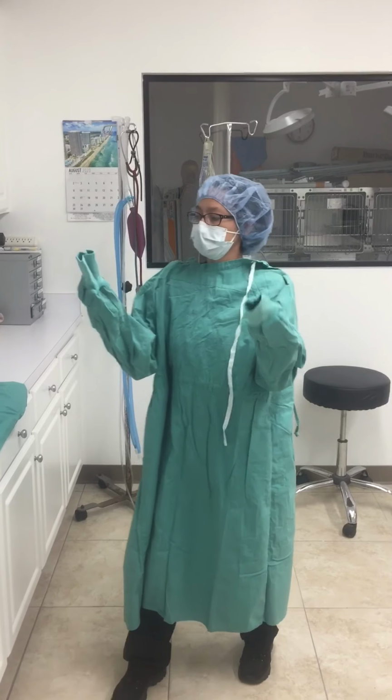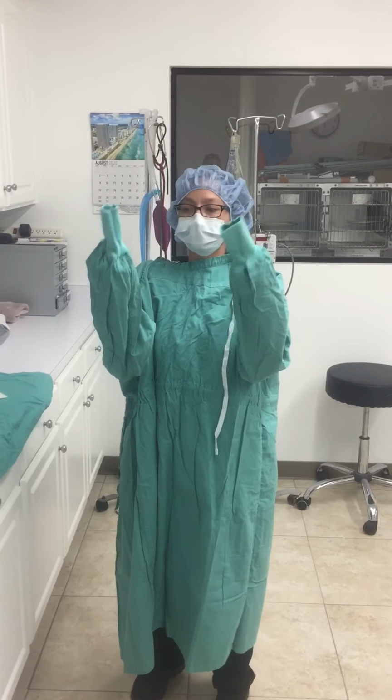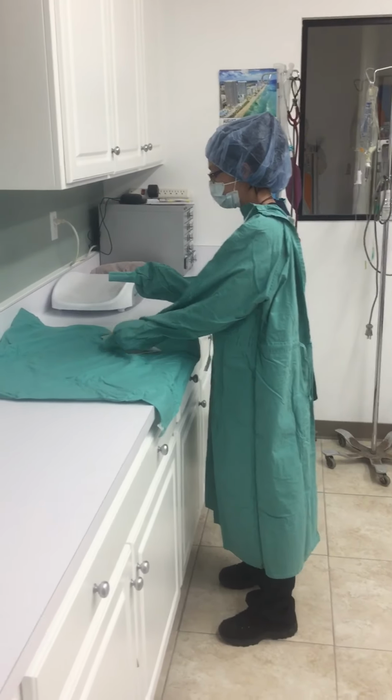And then next step is you want to make sure your hands never come out of these cuffs. That is the most important thing with closed gloving. Hands never come out of the cuffs here. So now we're going to come to our sterile zone here. I have my gloves already out.